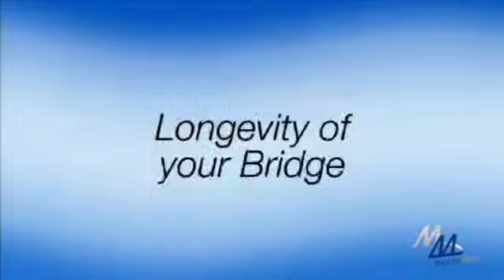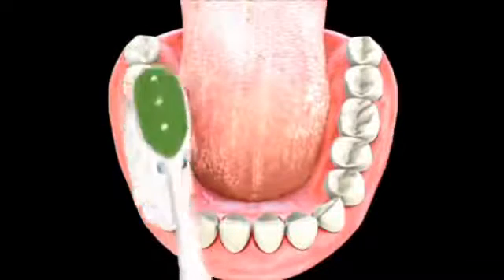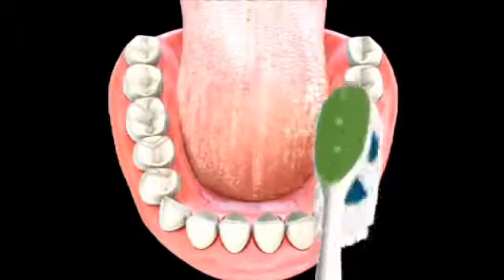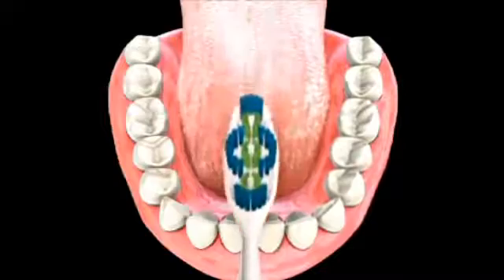Please keep in mind that the longevity of your bridge depends in large part on your oral hygiene, diet, and the health of the supporting teeth and gums, as well as the quality of the material in the bridge. Please ask your dentist for proper brushing and flossing techniques.